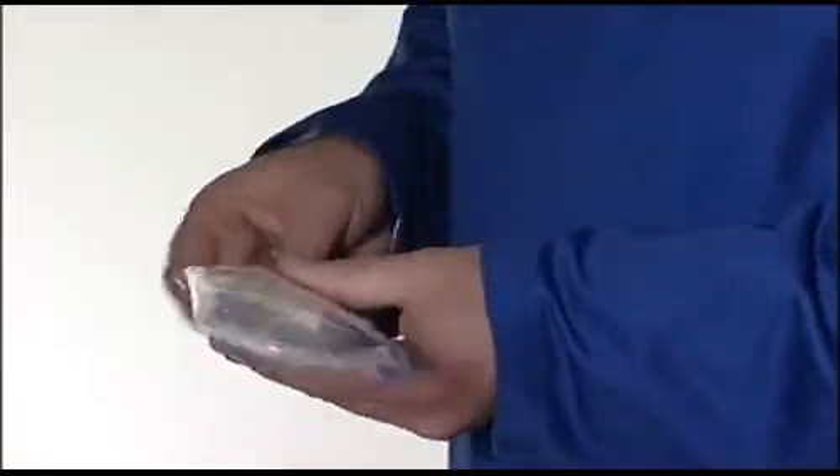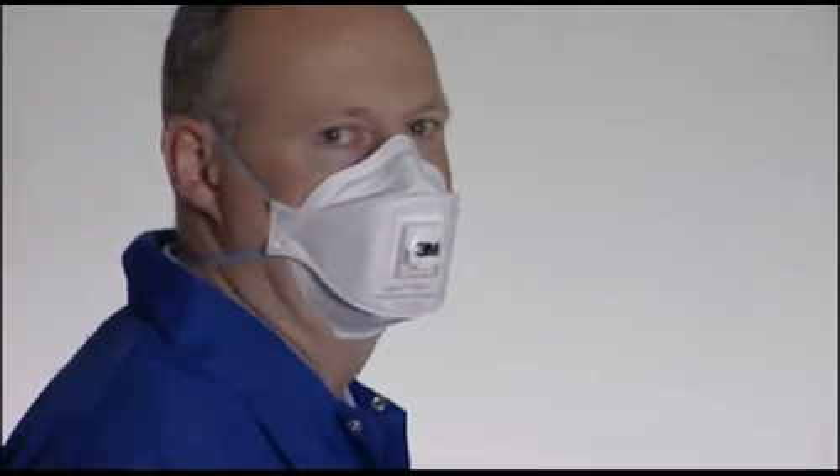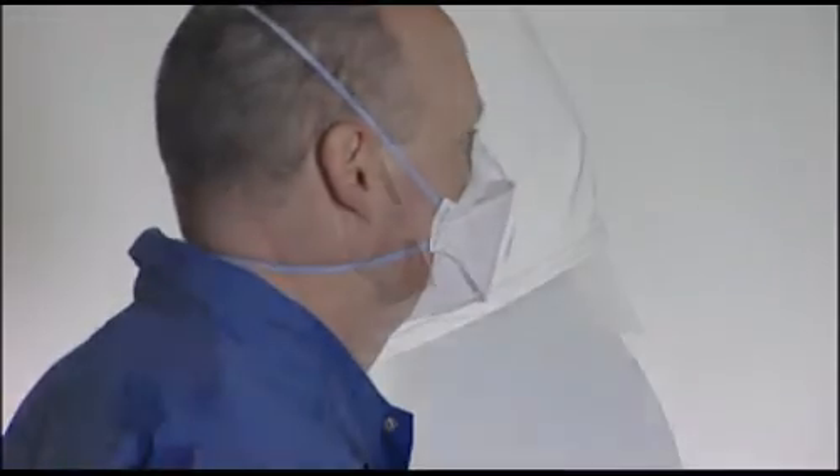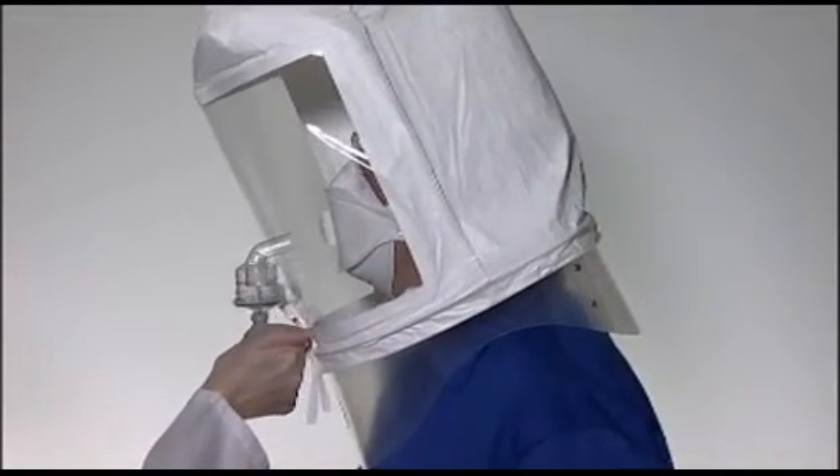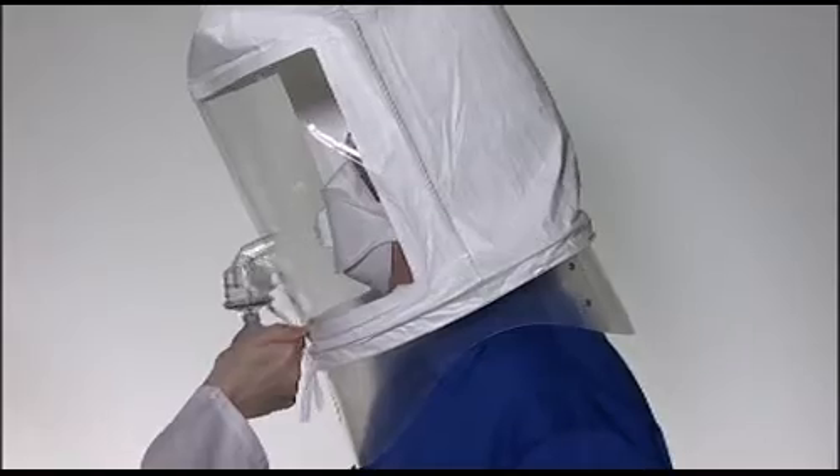The performance of your respirator relies on an adequate seal between the respirator and your face to ensure contaminated air does not leak in. The method of measuring whether or not you have an adequate seal is to pass a face fit test. Fit testing should not be confused with a pre-use fit check, which should be conducted every time you fit your respirator.